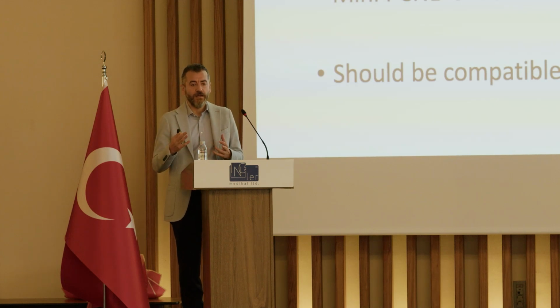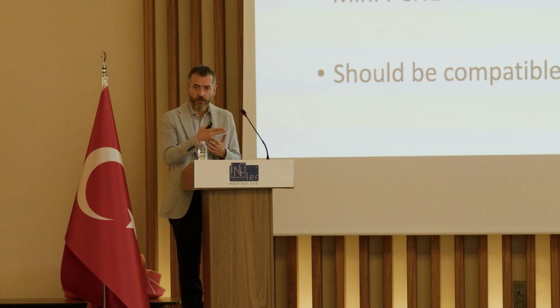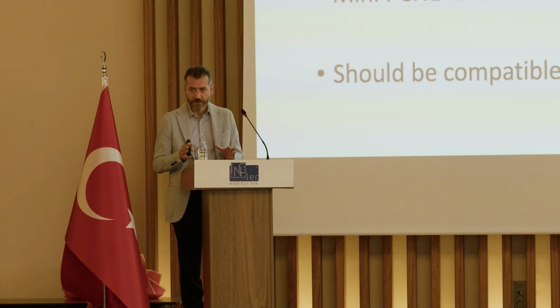I mean, as urologists, we need to have enough technical knowledge about the endoscopes, their outer diameters, their working channels. In the end, some of the nephroscopes have limited working channels. So if you try to put a huge lithotripsy probe inside that, it will not fit. Or you can fit it, but you will no longer have any irrigation. So in the end, we need to be careful about the selection. You can just deliver a lithotripter with a huge probe, an ultrasonic one, but if it's not compatible with the working channel of the nephroscope that the surgeon uses, then it will not be a successful procedure in the end.